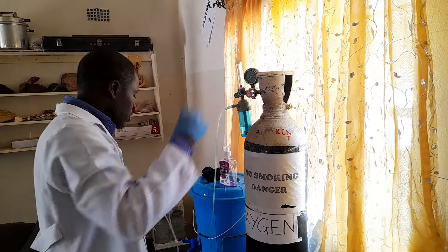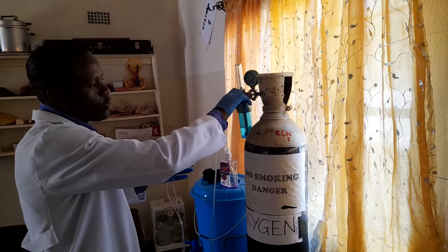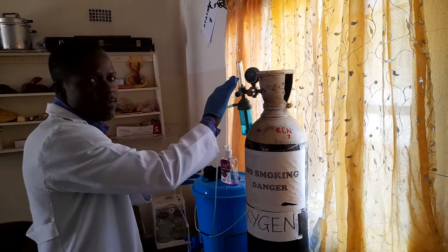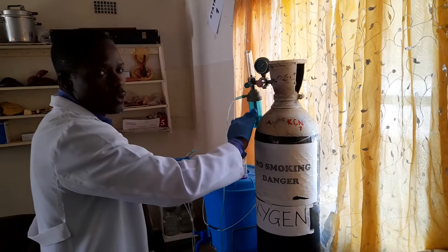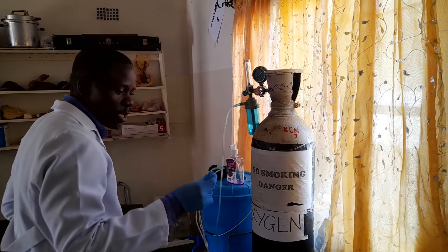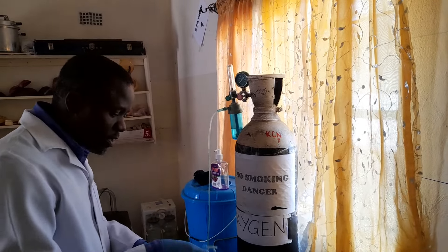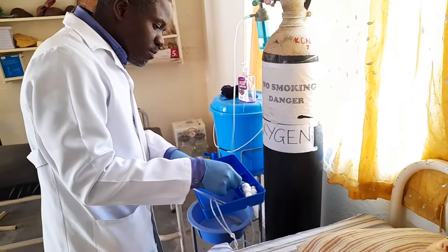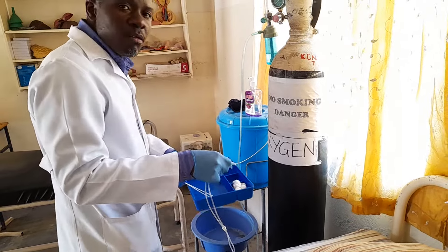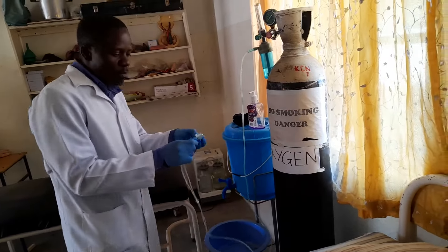Open the flow meter and set it to five liters per minute. You'll be able to see bubbles here, meaning oxygen is flowing. Then you add normal saline or any suitable liquid into the humidifier. If there are bubbles, it confirms oxygen is flowing. At this point you can wipe because there may be water.